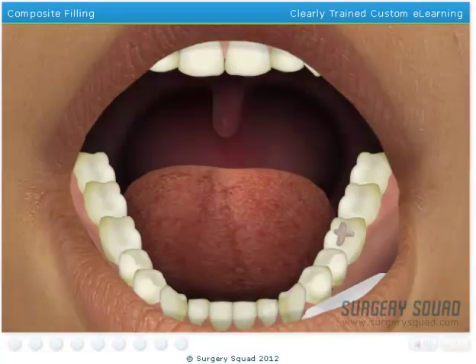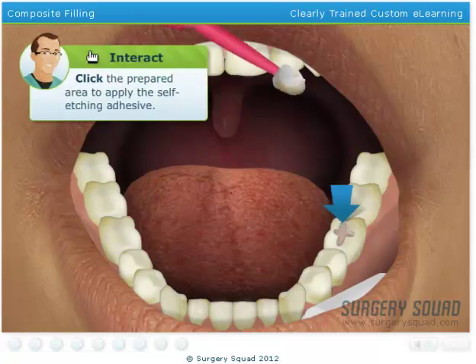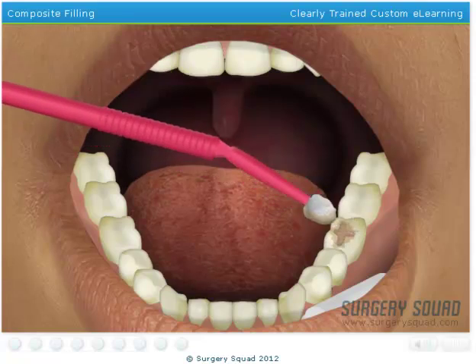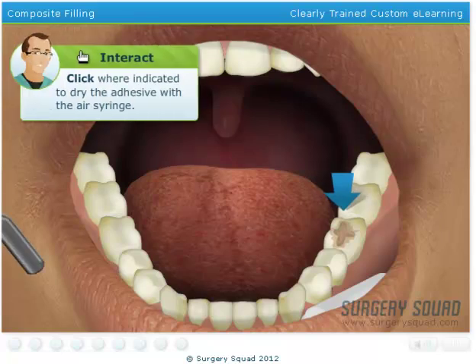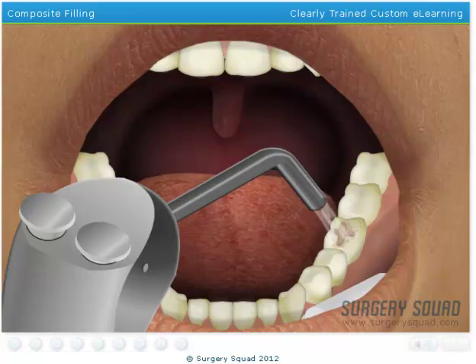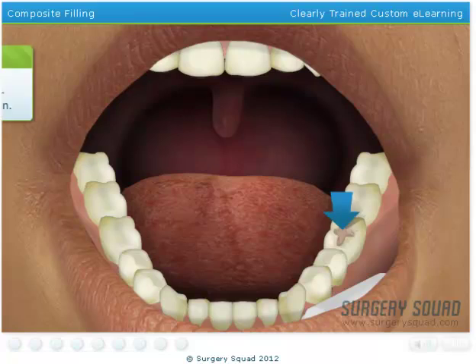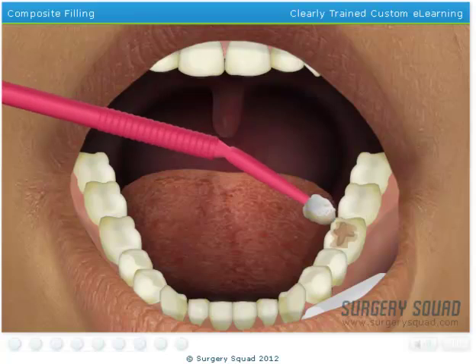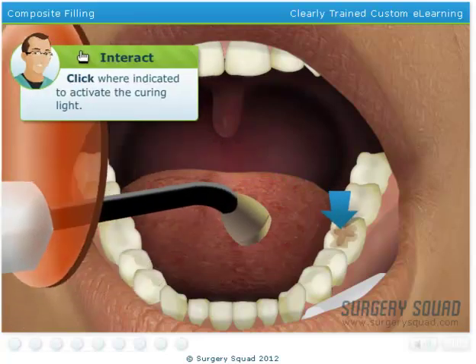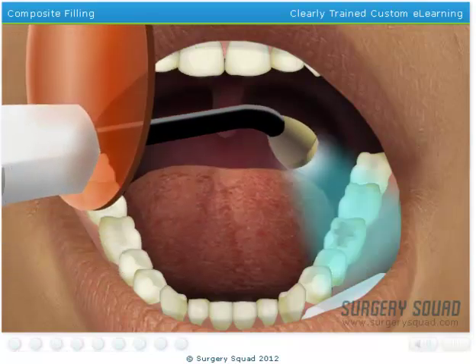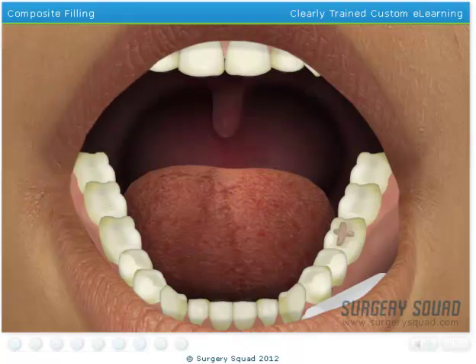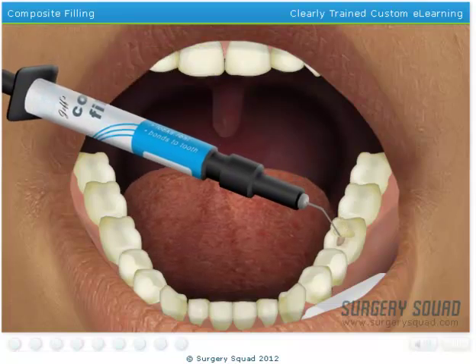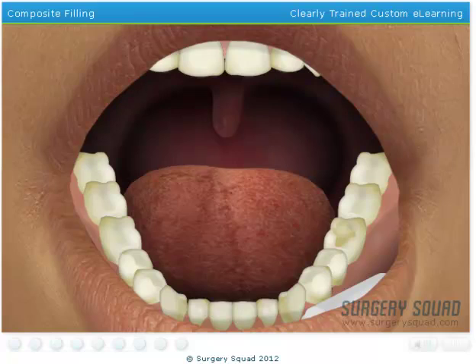For a composite filling, we need to apply a self-etching dental adhesive to the prepared area of the tooth. This creates a rough surface that helps the filling bond to the tooth. Now dry the area using the air syringe. Next, apply the self-etching dental adhesive to the prepared area one more time. Use the curing light to harden the self-etching adhesive. Now take the composite filling syringe and place it into the prepared portion of the tooth.